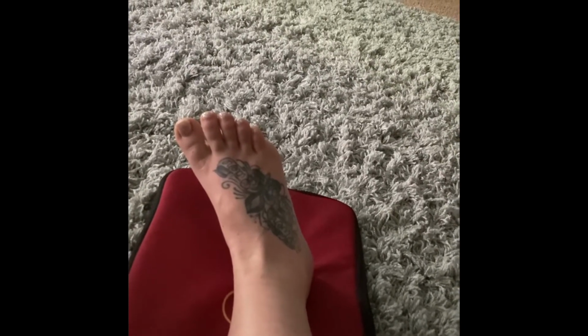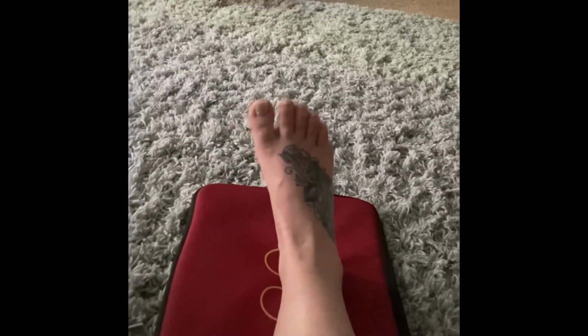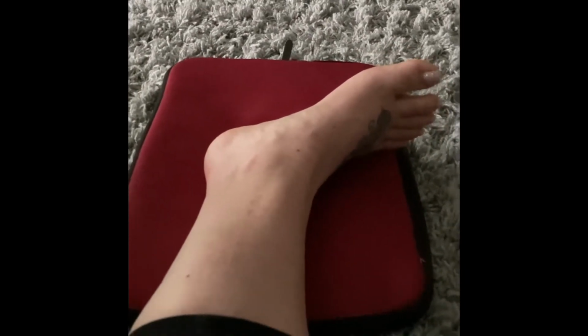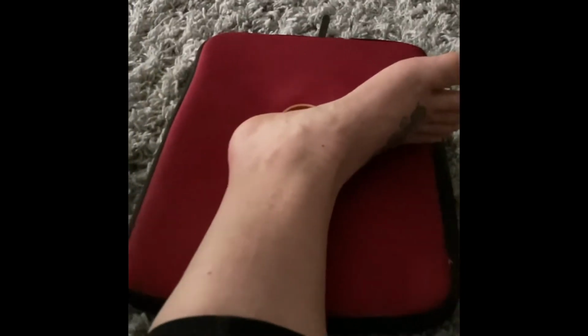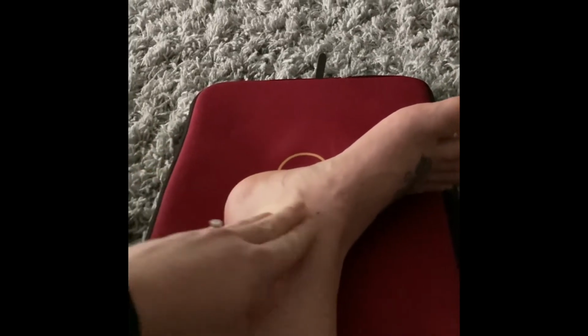And then the lateral ankle, we need the patient's leg extended and have them roll towards the affected side. So we would have them rotate laterally, like so. And the leg, so the foot and the leg are both in the lateral position, and the central ray would be going perpendicular to the mid-ankle joint.